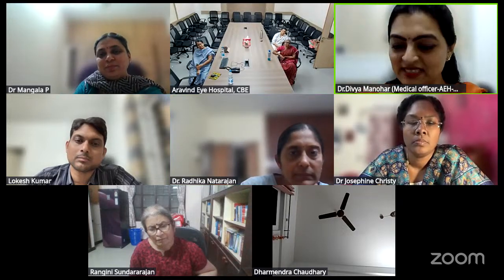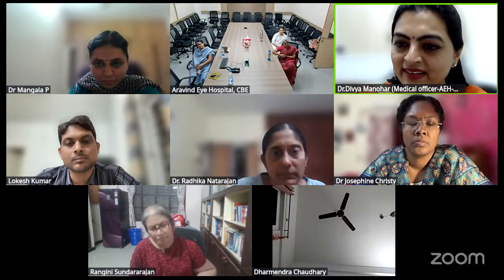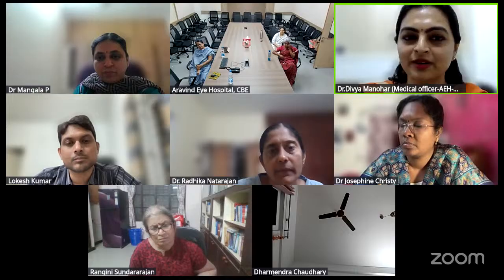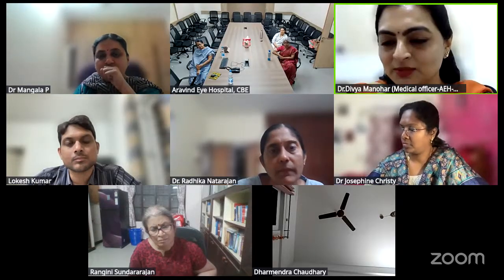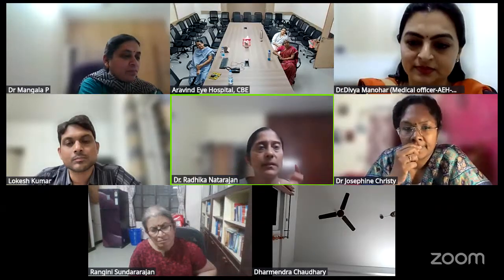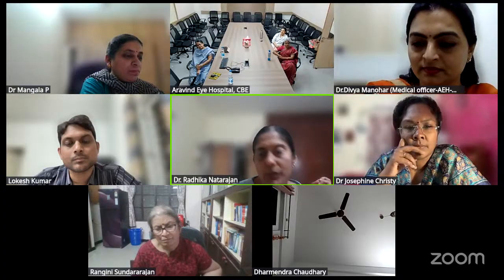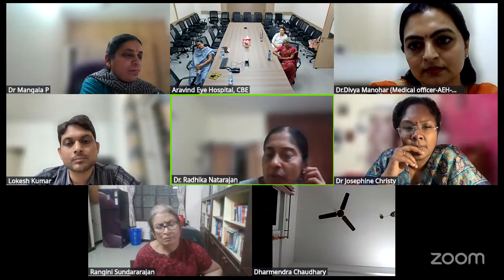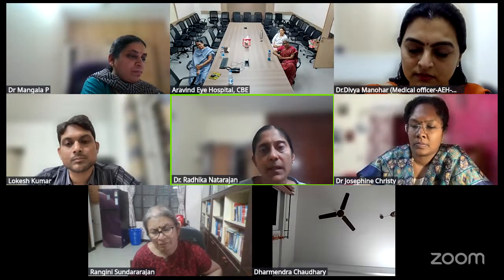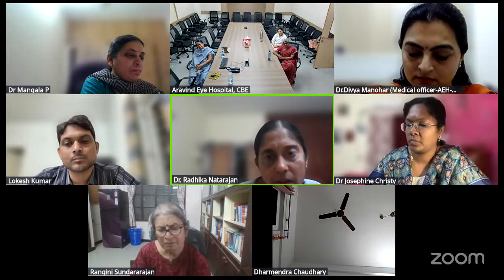Radhika Madam, one more question regarding cross-linking and topo-guided PRK. What's your thought on it, and when do you actually do it for patients, or do you have any criteria? Dr. Divya, it's a limited spectrum of indication. You want to regularize the cornea to an extent that the patient gets reasonable spectacle corrected vision and a better fit of contact lens, but you don't want to weaken the cornea further.